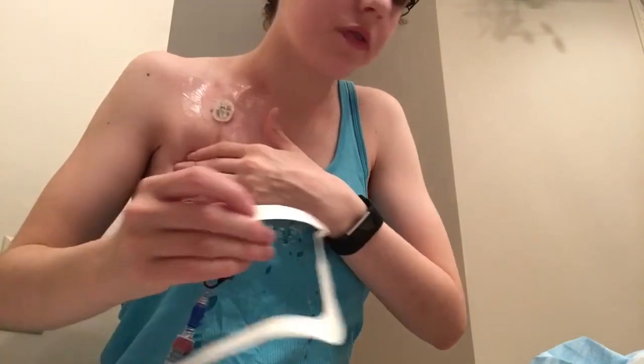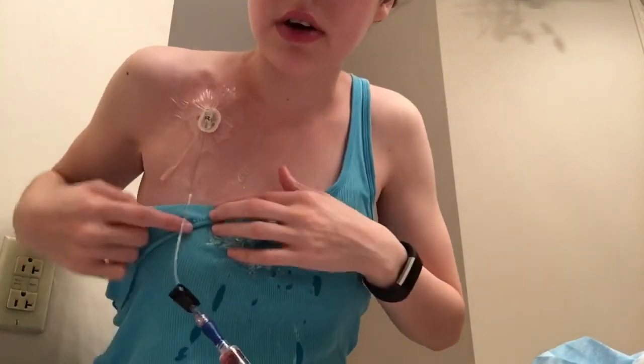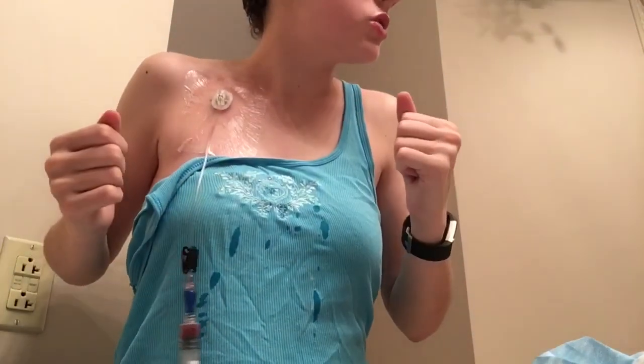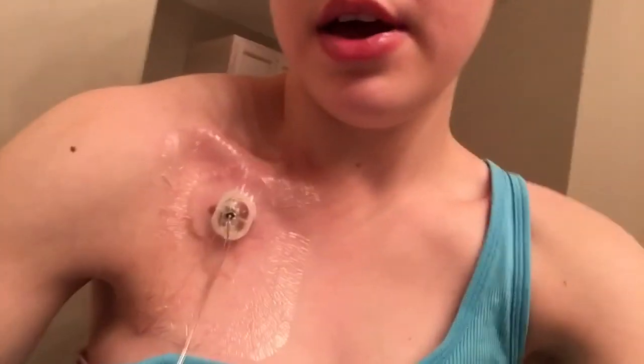All right, so that's perfect. I don't have my Band-Aid right here to put under the bottom so this part doesn't pull up. It's in my room. So that is it for me accessing my port. Doesn't matter which way I put the dressing on, I like it down because otherwise it gets too close to my armpit and it gets in the way.